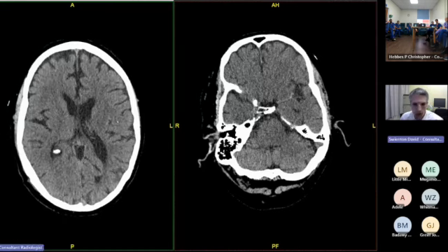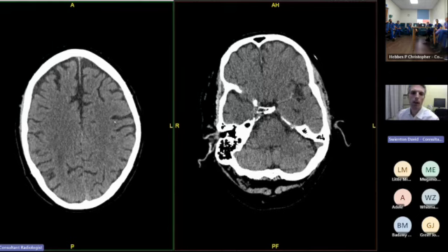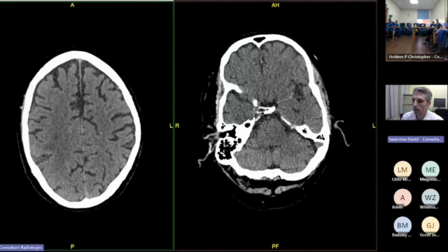So I'm just going to go through some bits I heard, and I think it's true. Talking about things like grey white matter differentiation loss, those are what I'd call findings, and they're important to recognise, and they go into radiology reports. But I think in a conclusion, somebody should say what they mean by that. The body of the radiology report is quite often how radiologists communicate with each other. But in the conclusion, you want somebody to say the grey white matter differentiation loss equals an infarct, and it's due to this, rather than just leaving the findings bare in the conclusion.